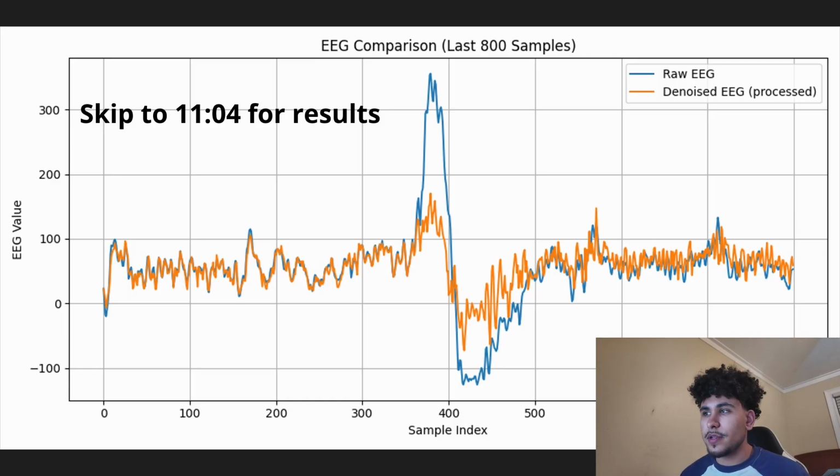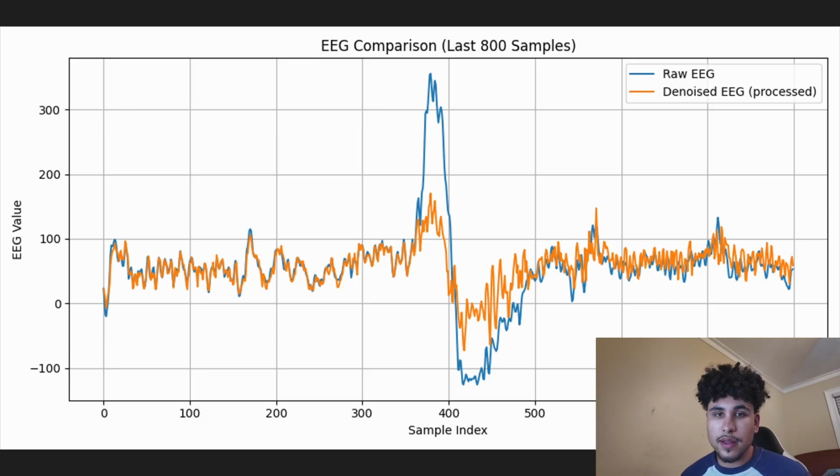Okay, so take a look at this picture on screen. It's pretty much just a test I did on my original denoising pipeline with data I collected of my own brainwaves. Now, as you can see, this original pipeline struggled with localized artifacts. What I mean by that is the model struggled with these giant spikes caused by things like blinking. In addition to that, the model attempted to denoise the entire signal, even parts of the data that appear to be clean. So if you look, it denoises this first part of the data, and sometimes that can remove features from the brainwave signal that we need for intention classification.